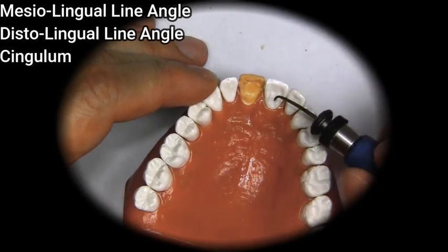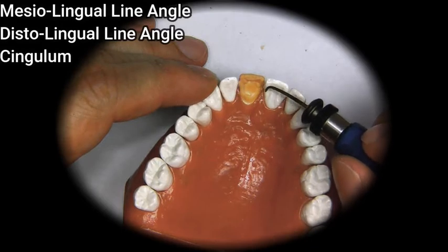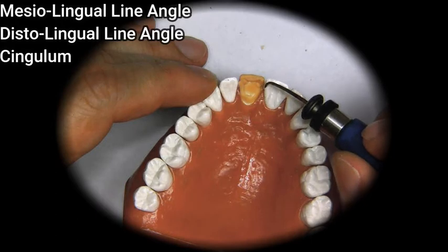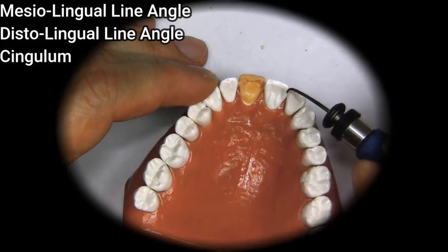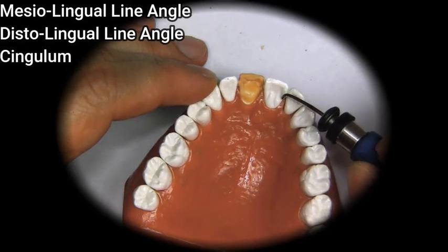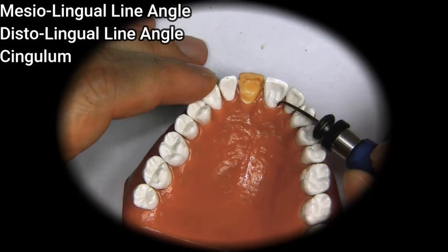So as you can see, the mesial marginal ridge, or the mesial line angle, is a slight curve this way. On the distal, however, it's a much more extreme curve, and it comes down to the neck of the tooth, again in a slight S shape.